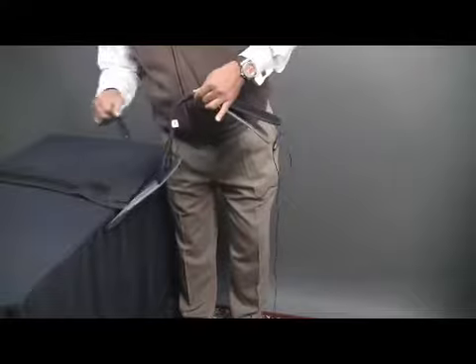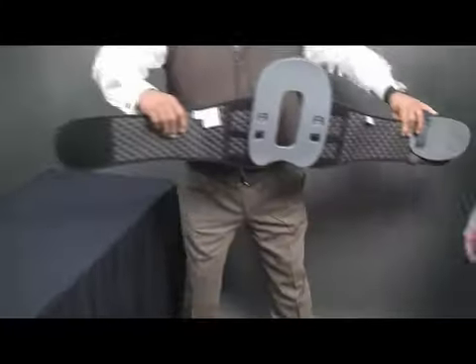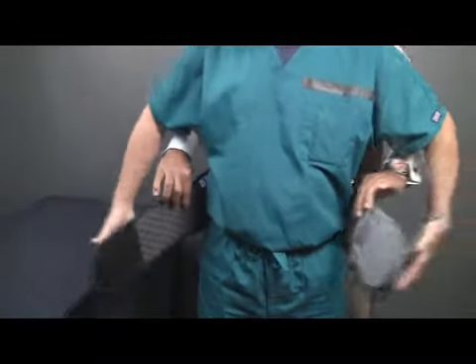Same principles apply: putting the power unit back as far as possible, giving it a pull, and now you're ready to fit the brace. Same principles apply. Right over left in the front, please.